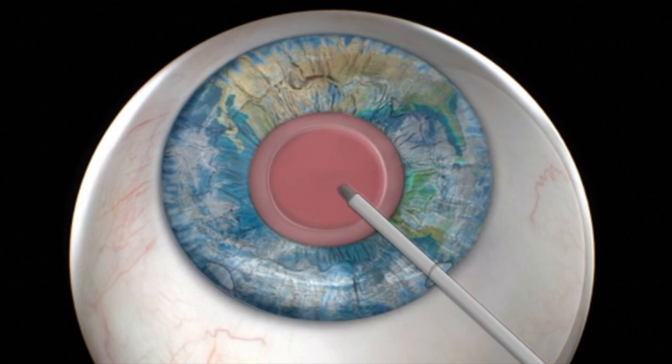The red color that becomes apparent after removal of the lens is due to the reflection of light from the eye's retina.